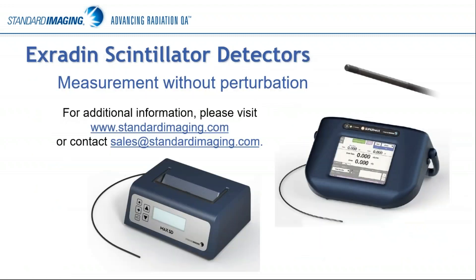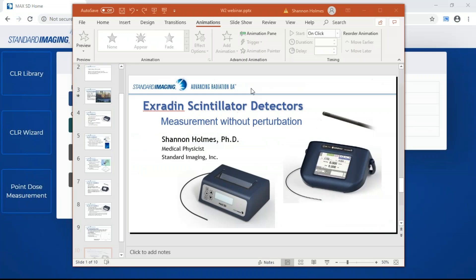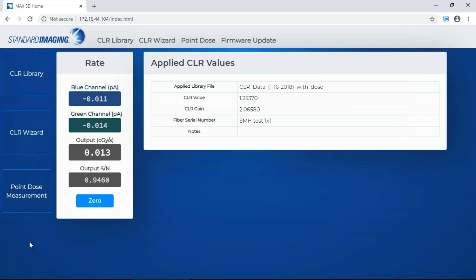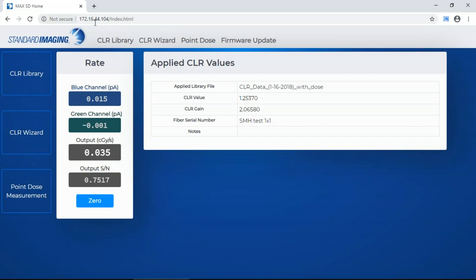I'm going to step into the interface for the MaxSD — it is a web-based interface. When you first plug in that unit and connect an ethernet cable, you can either directly connect to your computer or connect it into your clinic network. It will display an IP address on the front, and when you go to that IP address, you get this home screen.